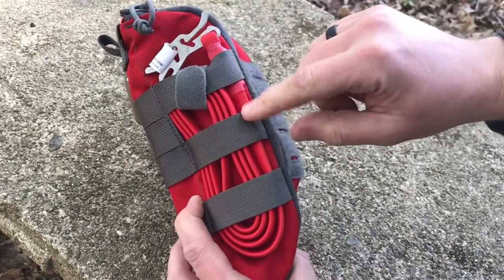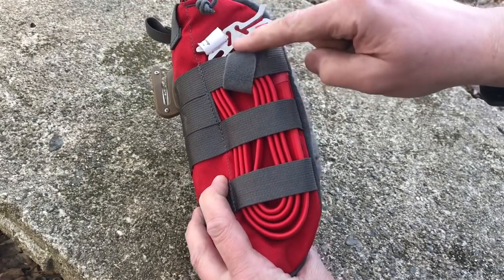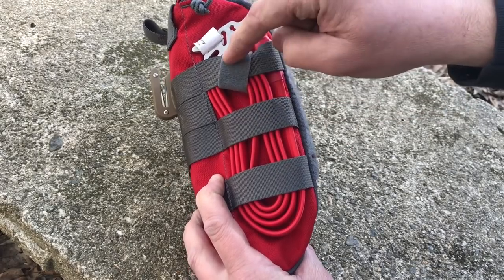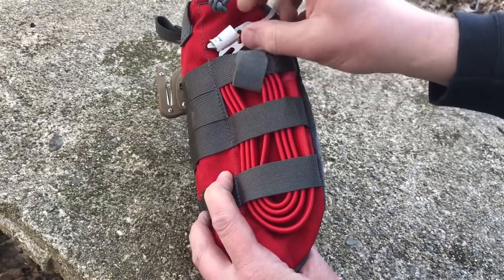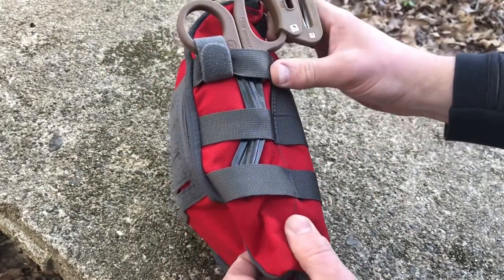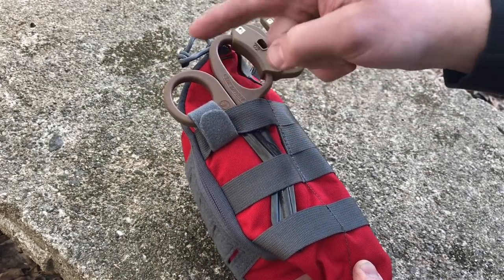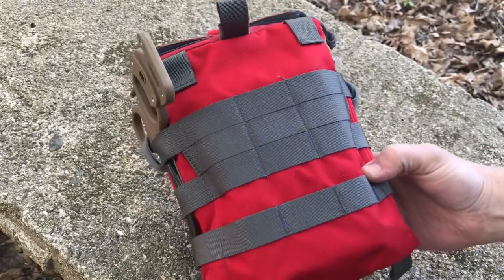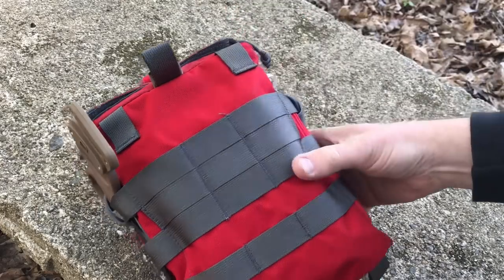On the side you can see we've got standard MOLLE webbing — three of them. They do include a little hook and loop. What I've done is put a tourniquet there and looped it, so if I want to get the tourniquet out I just take that off and pull it out. On the other side I've run some shears through here, and I took the hook and loop and looped it around so they can't fall out easily. On the back you've got a lot of MOLLE so you can attach more gear or attach this to something as well.